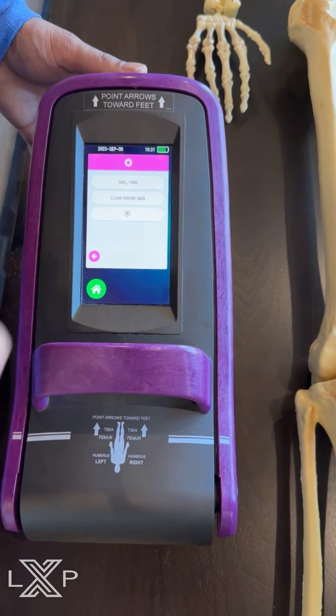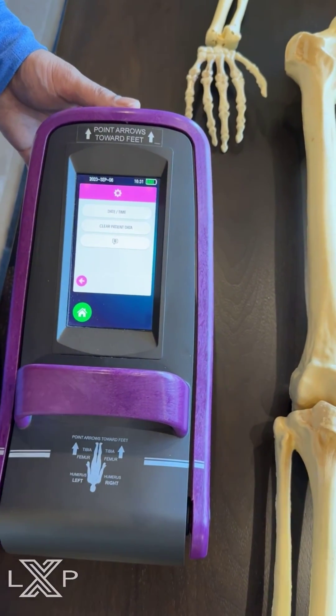It does track things like date and time, and it's very user-friendly.